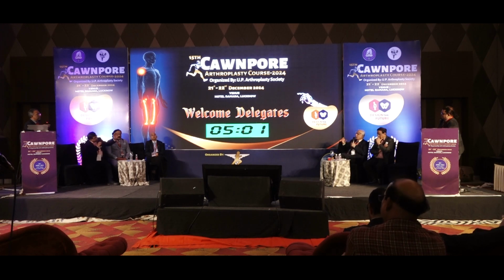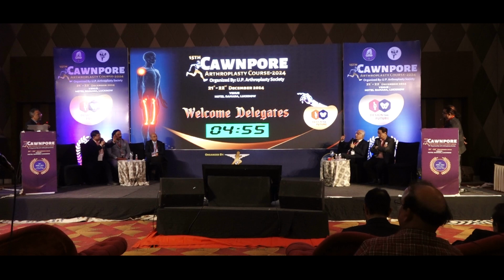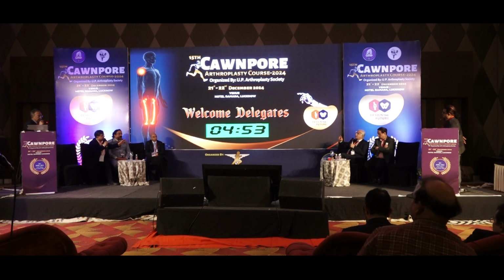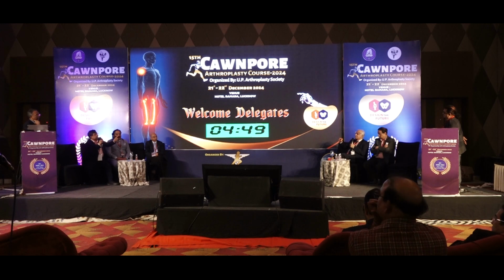Now, small, medium, large, in what dimension? I don't exactly know, but it's an approximation. So it's not like your definitive implant. It has to be either the size of the component that we removed, or a little smaller.